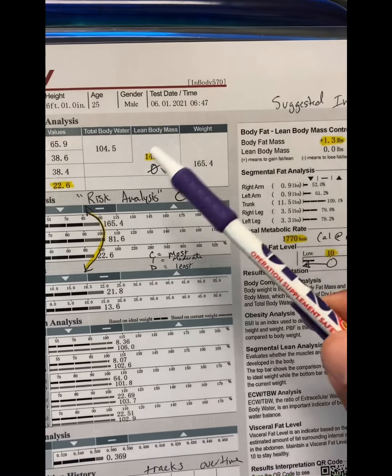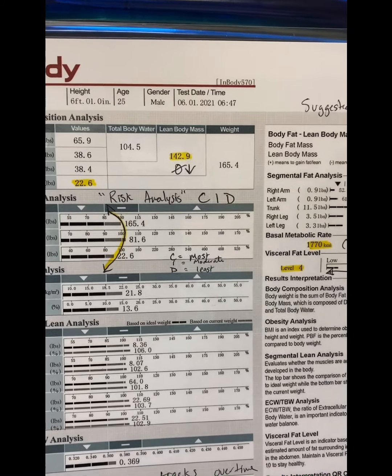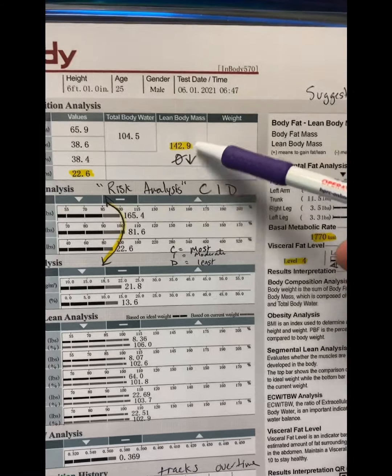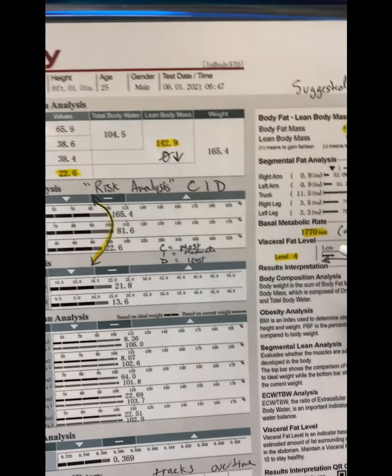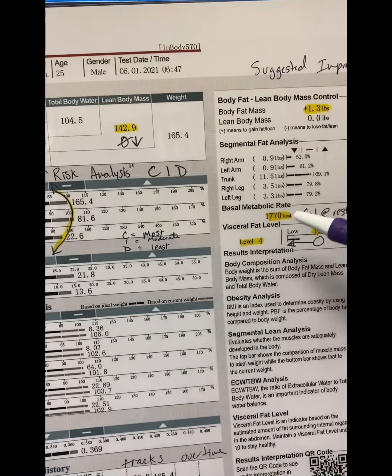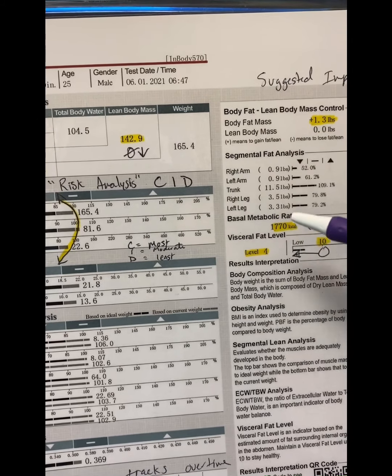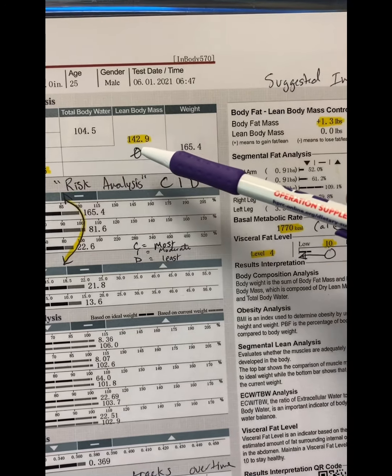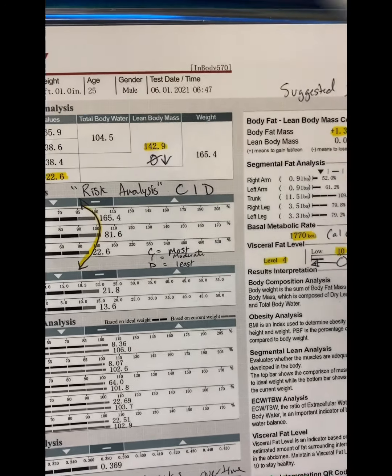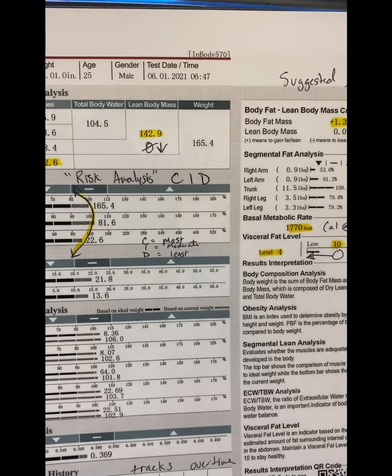We're going to go over to the left to where you have lean body mass. That's bone, blood, teeth, muscle, hair, everything that makes you you. You never want that to decrease, okay? This number is going to correspond to your metabolic rate, the amount of calories that you're going to spend at rest. So the higher this number is, the more calorie needs you would have. This number never needs to decrease, it actually needs to increase, so that way you are more capable as time goes along.